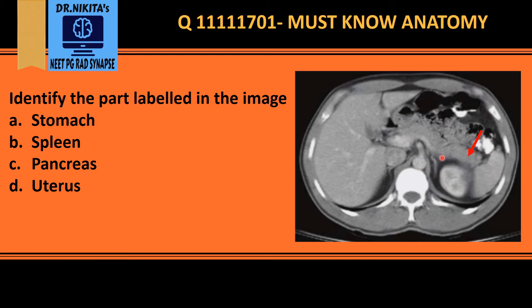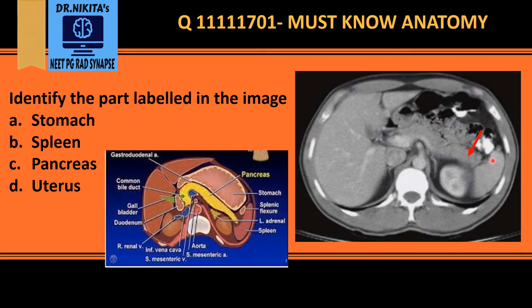This is a contrast-enhanced CT scan of the abdomen. The labeled structure is the pancreas. Looking at the schematic diagram, the pancreas consists of the pancreatic head, body, and tail. We know that the pancreatic tail is in relation to the spleen.